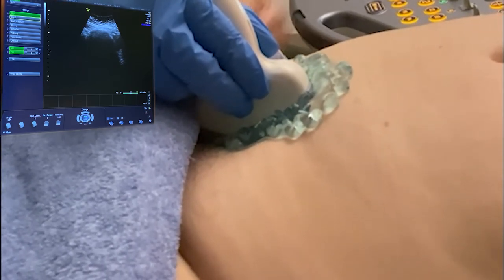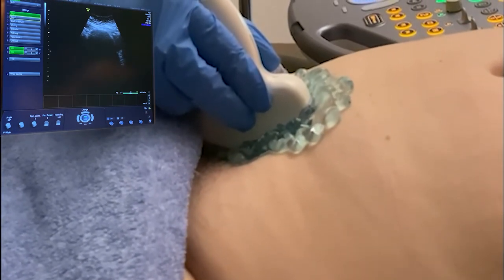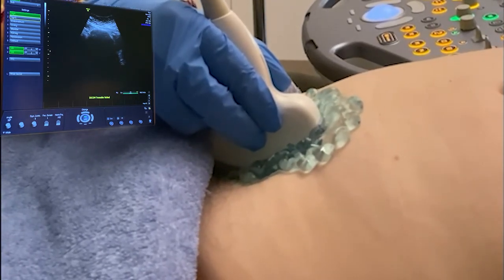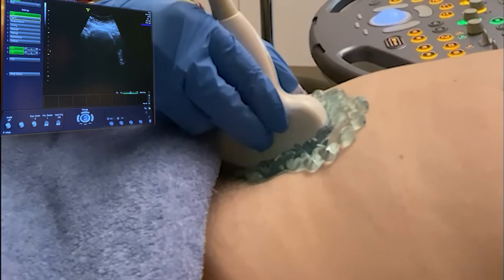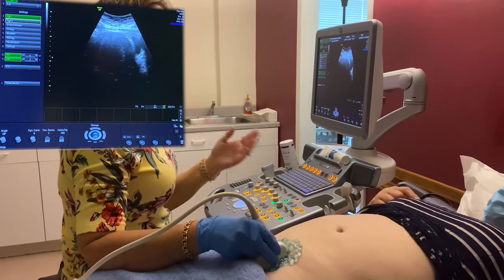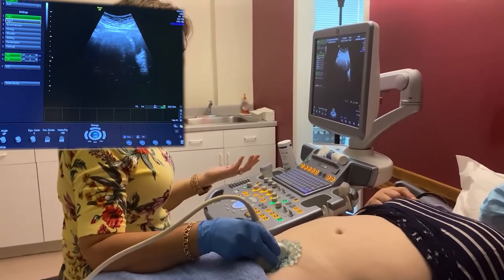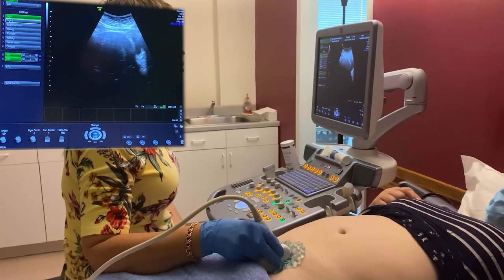So this gets me right at the isthmus of the cervix, and you should see, anterior to posterior, the patient's bladder, and the patient's either their vagina or their cervix. So it depends on how many times, and if your patient has ever had a baby, the size of the uterus, if there's any pathology within the uterus, as to what you're seeing.